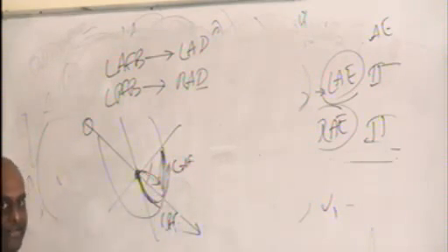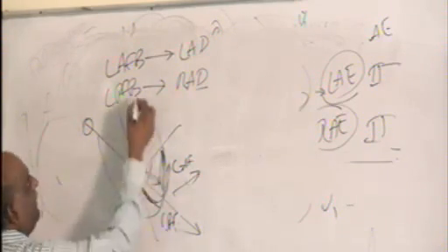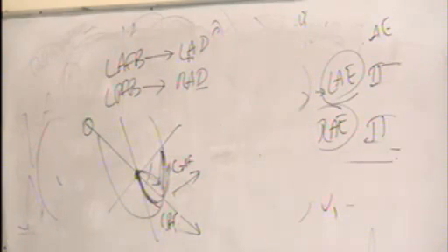So left posterior fascicle finishes its activity and goes and supplies all the areas earlier supplied by left anterior fascicle. So the entire electrical activity is getting directed towards the left side. That is the reason what axis deviation you get? Left axis deviation you get.